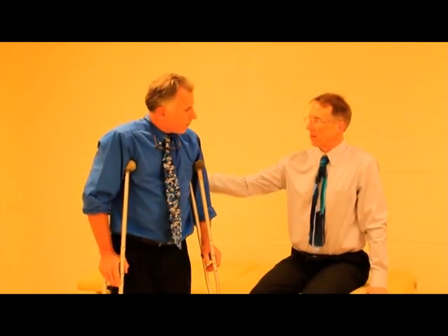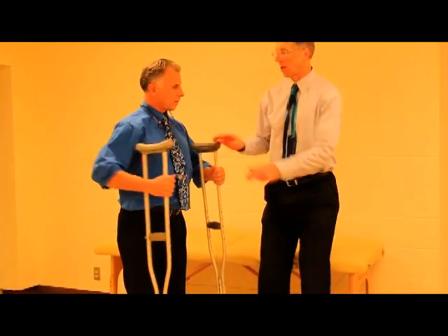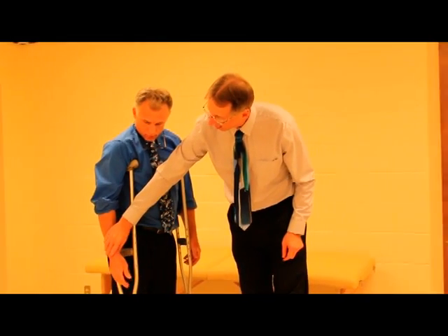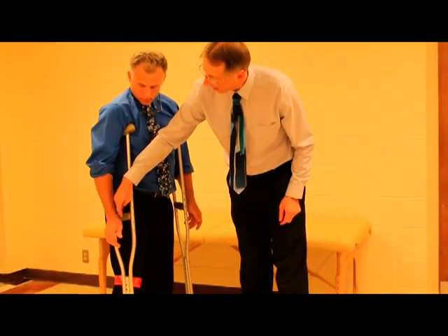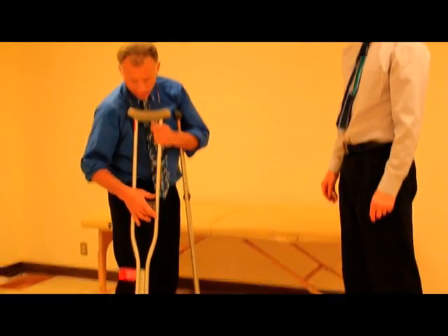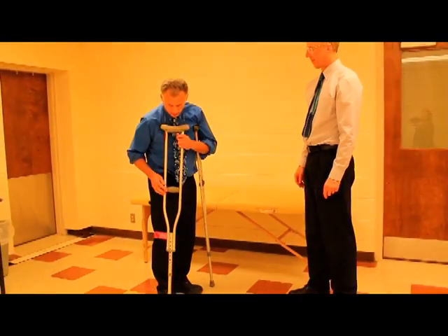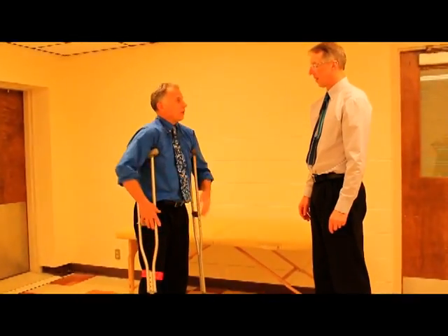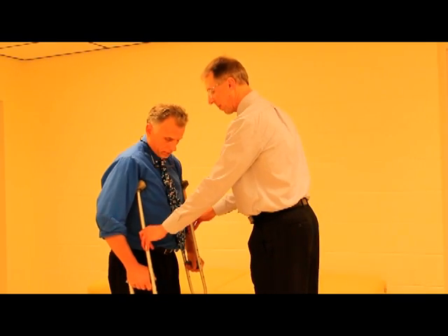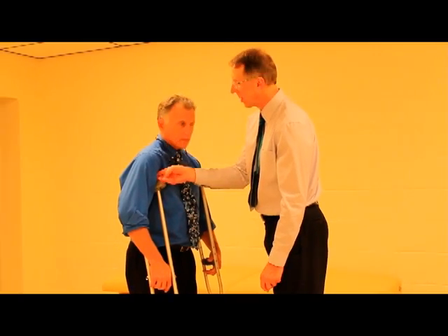So then you stand up with good posture, and when you're standing with good posture you want to go ahead and put the crutch underneath your arms. If you let your arms hang down, the wrist should come about even with the handles here. Right, so if they were lined up down here, these handles have to be moved as well — though those unfortunately do not adjust nearly as easily as the overall height. So first, let's make sure the height is right.